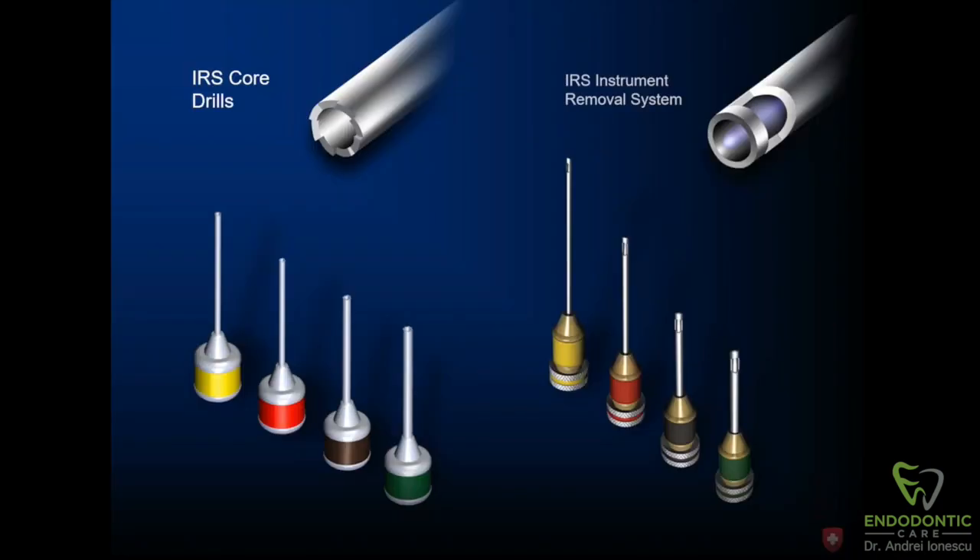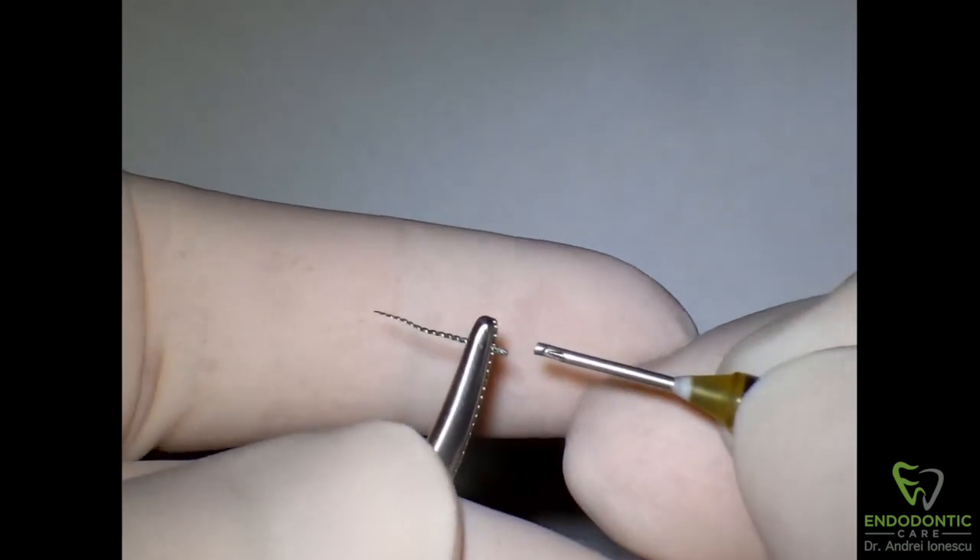The IRS system consists of a series of core drills or trefine drills that can help you trough around the separated instrument — those are on the left — and the actual instrument removal itself, which you'll see on the right. It consists of an outer sleeve that goes around the head of the file, and it has a little window of fenestration and an inner rod which engages the file into place so you can pull it out and retrieve it.